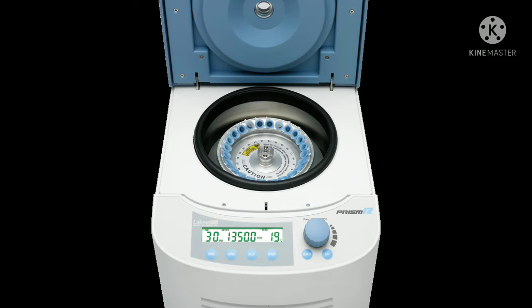Today we want to learn how centrifugation helps in blood banks. It mostly helps to separate the red blood cells, white blood cells, plasma, and platelets. All these are separated through this process. Because they are not soluble and are very hard to separate, this uses the centrifugation process.